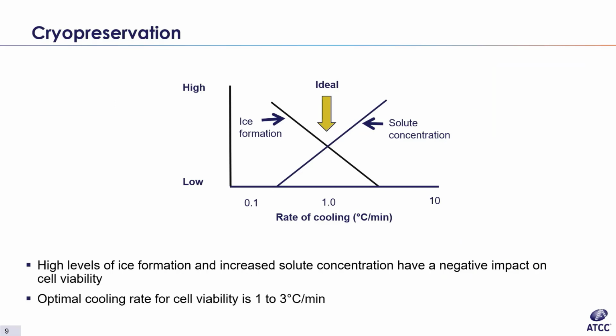In the next several slides, we want to discuss techniques on cryopreservation. I want to first go over the basic theory behind cryopreservation and how it works. So the freezing process is a complex phenomenon that's been studied for decades. Cellular metabolism stops when all water is turned to ice. This, however, is largely detrimental to the cell's health.